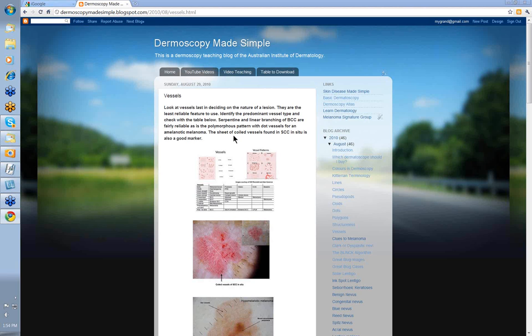If you look at tumors and how they grow, the vessels that we see through the dermatoscope depend on the thickness of the skin we're examining and the thickness of the tumor. Skin tumors get their blood supply from the dermal plexus and the vessels come off as loops. If a tumor's thin, then seen from above, these little loops look like dots.